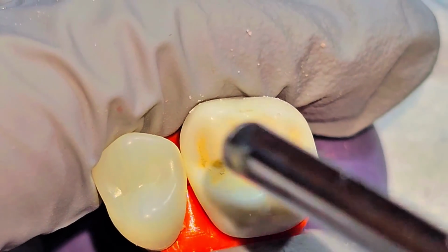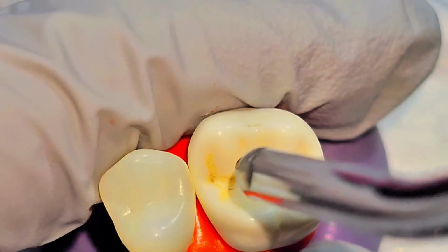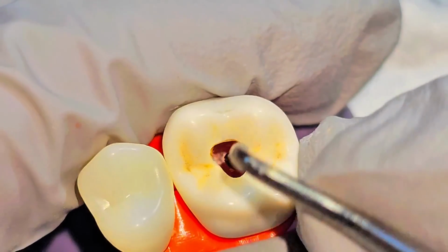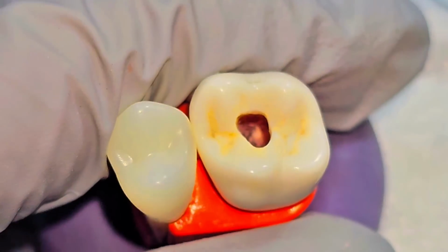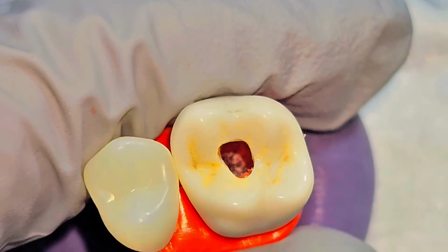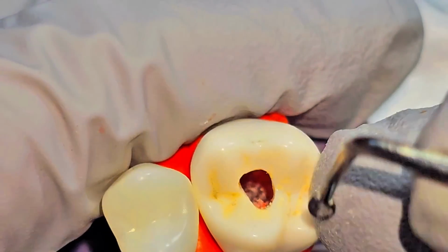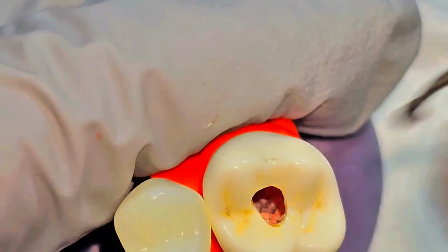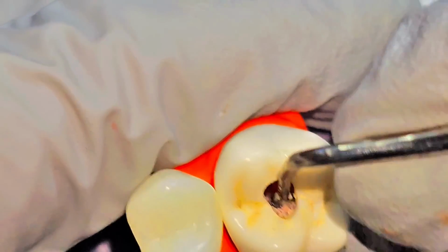What I mean is this, because some say that this can cause air embolism, so it is not recommended to use too much airflow into the canal. So they use a tip that reduces the air volume, or the high speed air coming out. But since it is a plastic tooth, it will not be a matter.